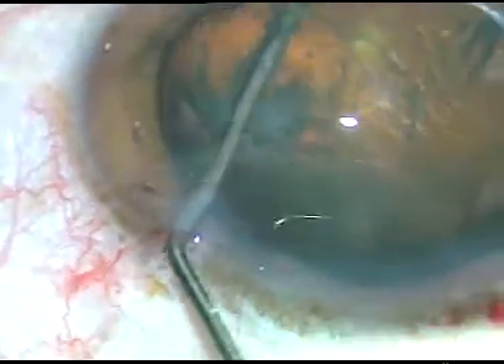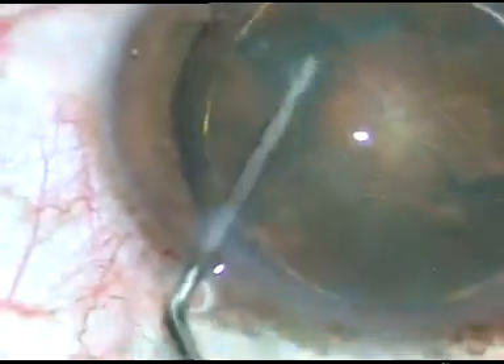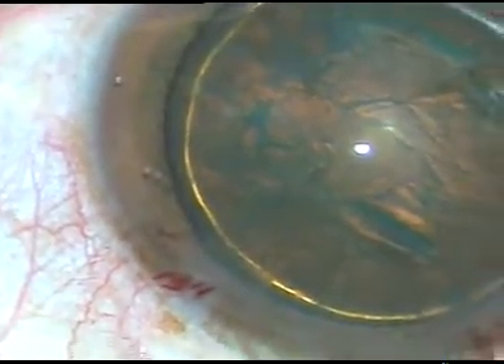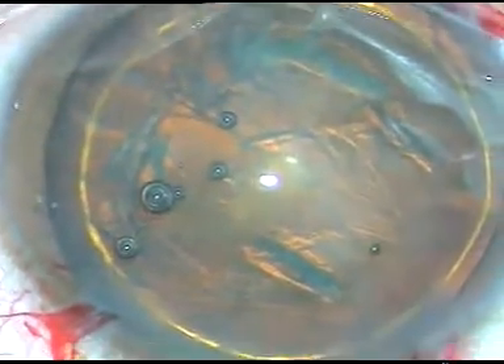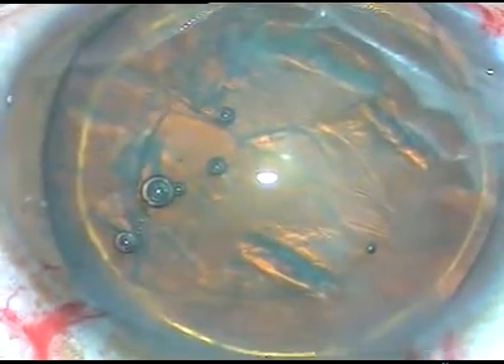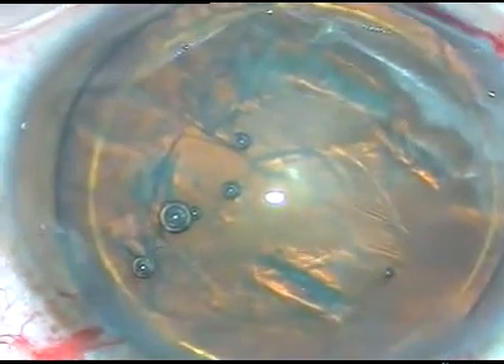The nucleus is rotated. In this case it is a soft cataract — I could do the lens tilt technique, but I am going to do mechanical slicing instead. Without applying any vacuum or power, I just give the nucleus support with the phaco tip, and with the help of the chopper, I slice the nucleus.